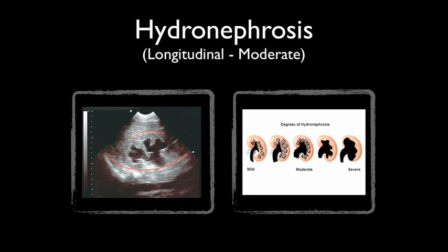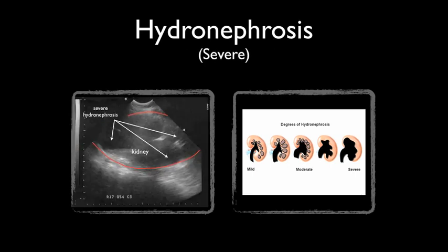Here's an example of moderate hydronephrosis. Recognize how much more pronounced the dilated calyces have become. This is an example of severe hydronephrosis. Note that the shape of the kidney is completely obliterated.